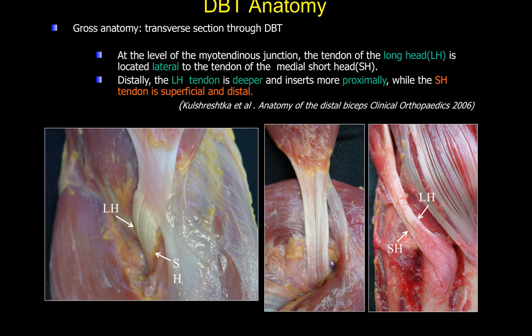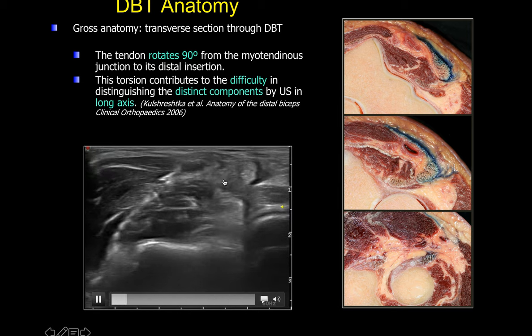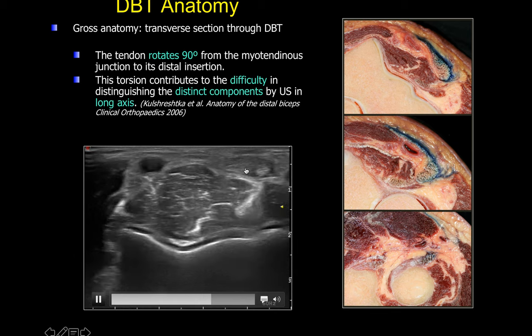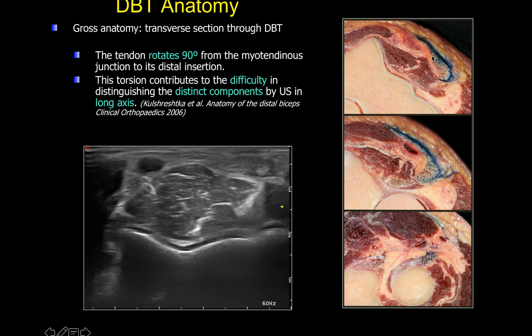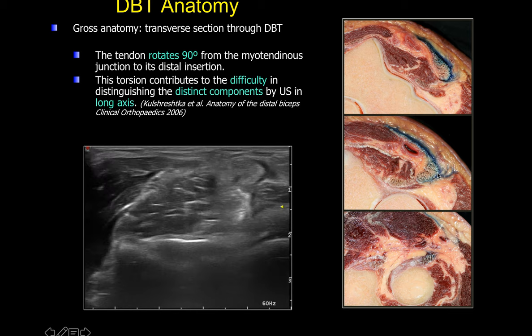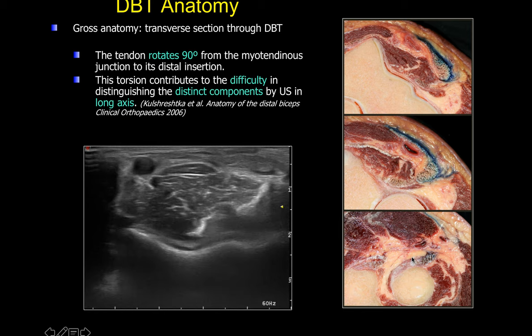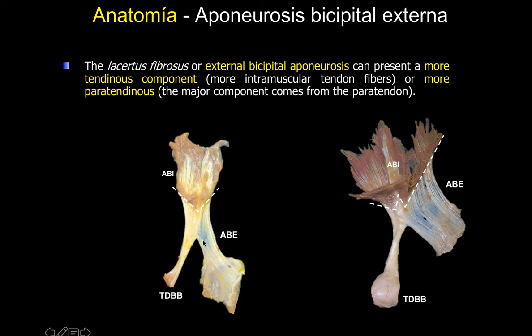At the level of the myotendinous junction, the tendon corresponding to the long head is located lateral to the tendon of the short head. Distally, the long head attaches deeper and more proximal while the short head is superficial and more distal. The tendon also rotates 90 degrees from the myotendinous junction to its distal attachment, with the tendon of the right arm rotating clockwise. This torsion explains the difficulty in distinguishing both components in the long axis. The lacertus fibrosus is also very variable, with some cases showing more tendinous components and others more paratendinous component.